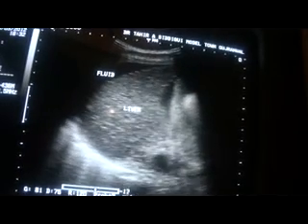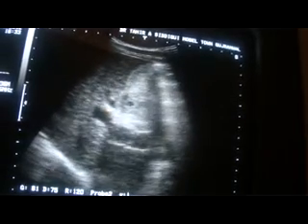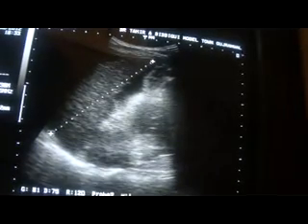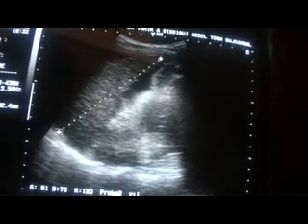Now, talking about the liver dimensions in cirrhotic patients, what will we say about the left lobe of the liver? This is the left lobe of the liver in longitudinal section, and I don't see this part of the liver — the second lobe of the liver — being shrunken or reduced in size. The right lobe measures 10.2 centimeters and the left lobe measures 10.5 by 5.7 centimeters.